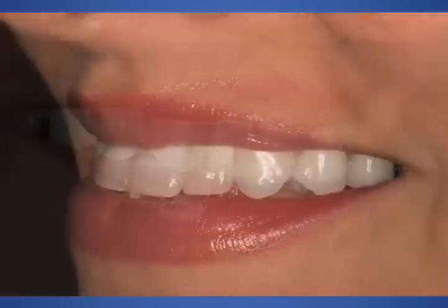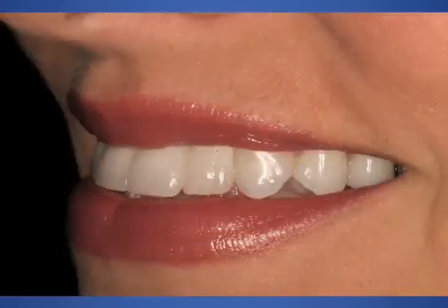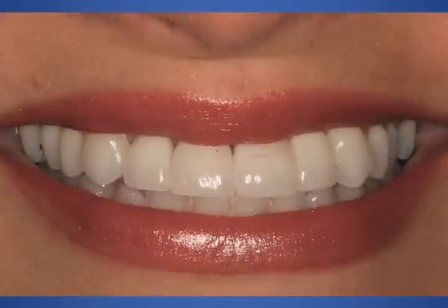Virtually placing the implants in this situation gave us a tremendous advantage over freehanding this case. Right and left lateral smile lines. And I think we achieved a decent final aesthetic. I know we really improved the quality of life of this patient.